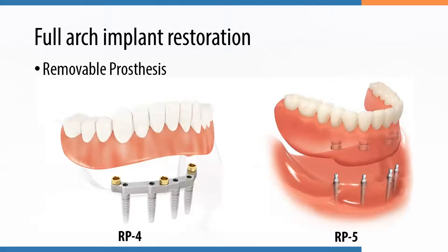On the right-hand side, we can see an RP5 type of restoration, and this is basically an implant-retained restoration, taking its main support from the ridge, same as complete dentures, but only retained with implant locators or other types of attachments. RP5 restorations would require a minimum thickness of 7 to 10 millimeters only, and obviously these could be removed by the patient and hence would have the advantage of better cleansability and easier maintenance for oral hygiene.